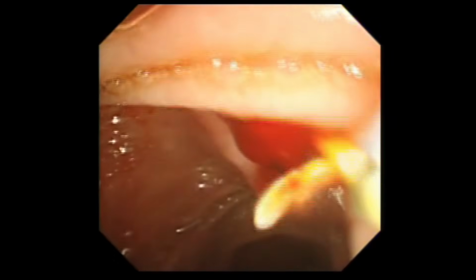Once we have a correct and a firm grip over the stent, then it is retrieved along with the endoscope and the procedure is over.